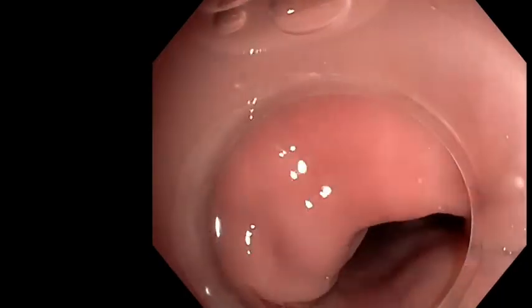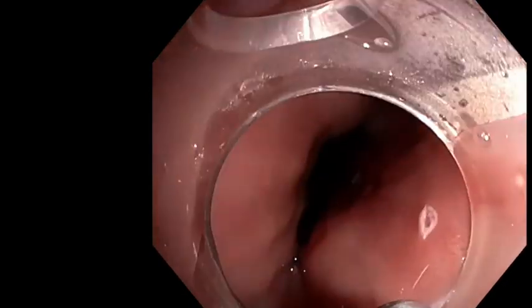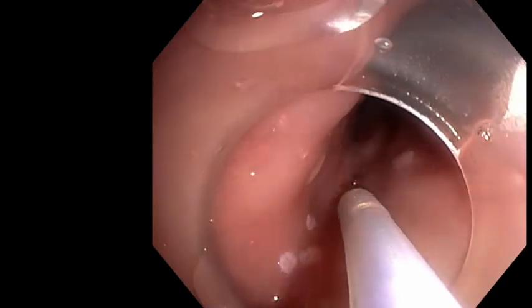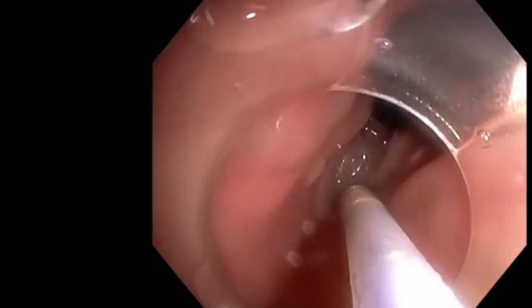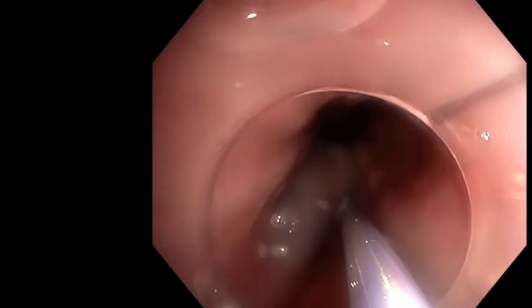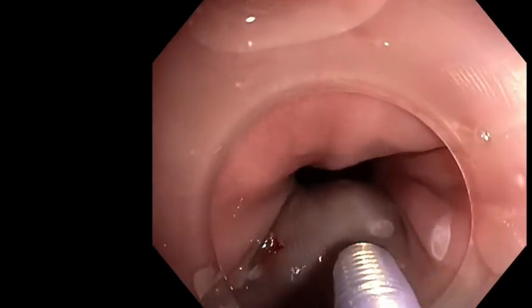Second example, here we will inject first at the lower part, it's an esophagus. Here you have a tangential approach, so your incision is a little difficult, but if you inject a lot the lower part, the anal part here for this esophageal lesion, you will make the mountain facing you.